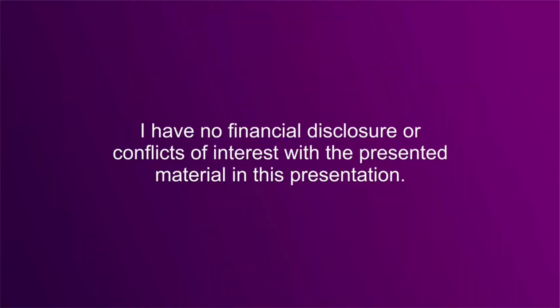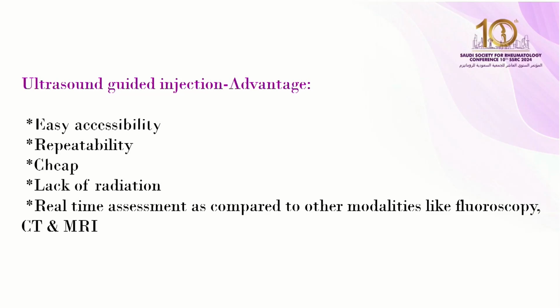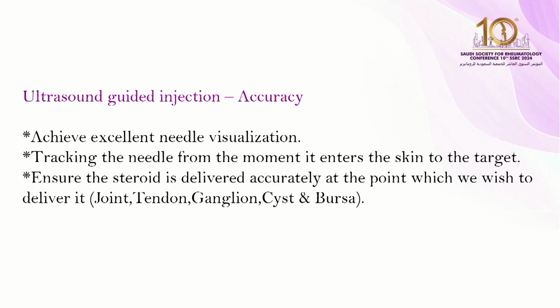Okay, I have no disclosure for the presentation. Let's talk about ultrasound in general in the musculoskeletal system. The ultrasound guided injection advantages: easy accessibility, repeatability, cheap, and lack of radiation. Real-time assessment as compared to other modalities like fluoroscopy, CT, and MRI.